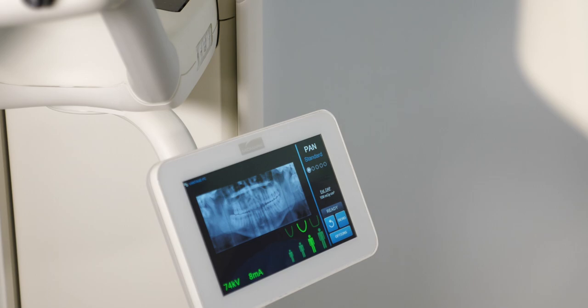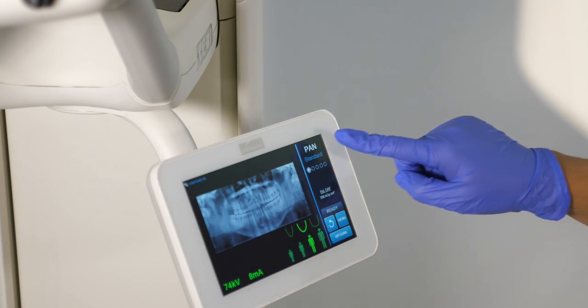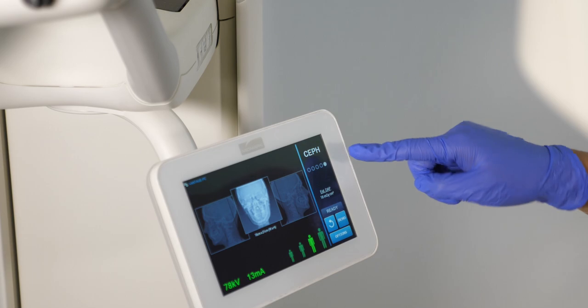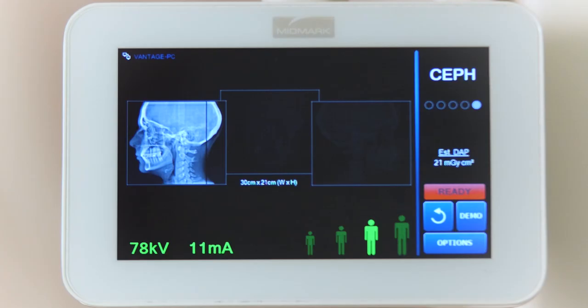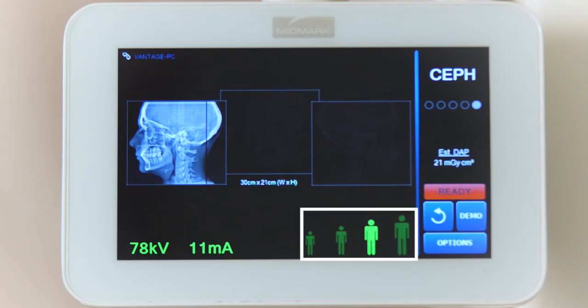To begin, tap the projection button on the top right of the Vantage Touch control screen to select the CEPH function. Verify the technique factors according to patient size and anatomy.